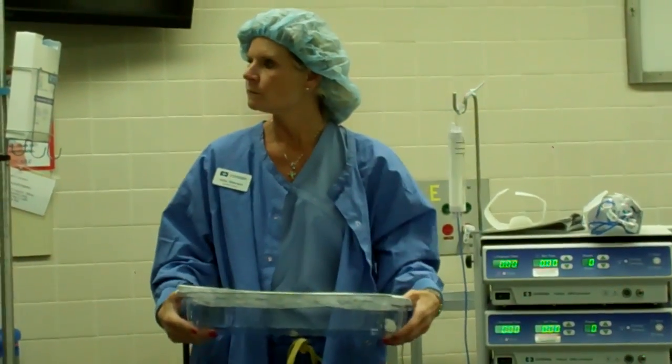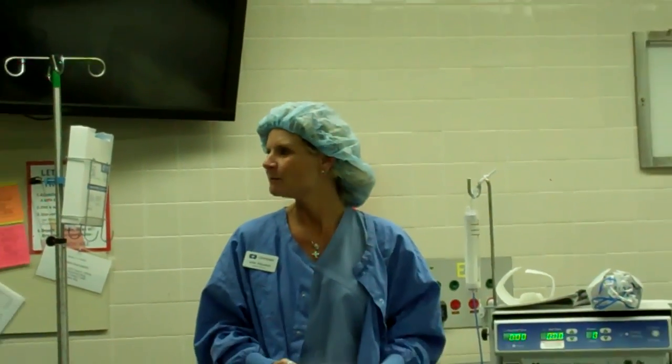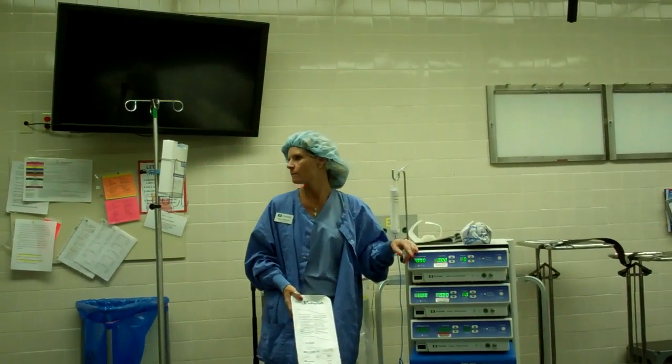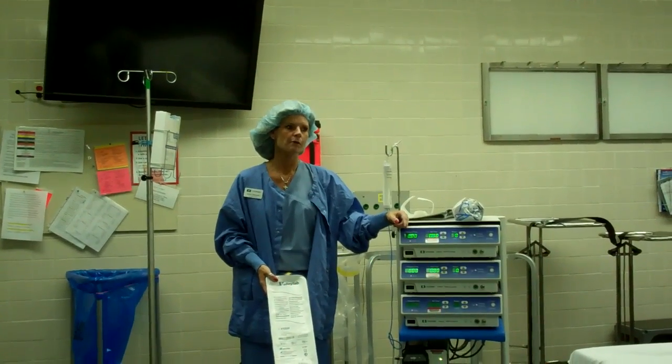Where to put the machine depends on the setup. Dr. Cheng usually stands on the right side of the patient, so it can go across from him. It depends on anesthesia and how many things are in your room, because he usually also uses ultrasound to find the tumor. You could keep the antenna on your field and pull the machine up when you're ready to use it. Don't open the antenna until he says so — he doesn't want anything open until he asks.